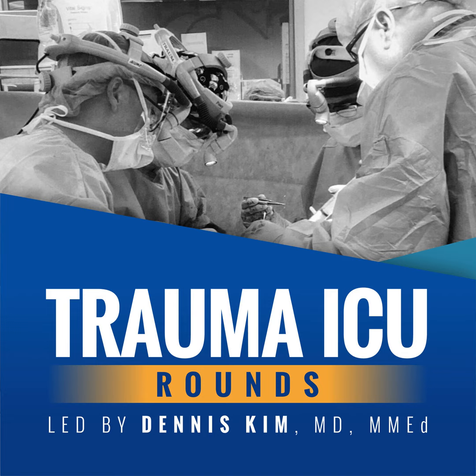Now, in terms of key take-home points, these days we're much less likely to perform a T-piece trial, and we simply use pressure support ventilation with a minimal setting somewhere between 5 to 10 centimeters of water, mainly to overcome or counteract the resistance of the endotracheal tube and the ventilator circuit. Although there are those that might argue that this level of support is probably clinically irrelevant or negligible.